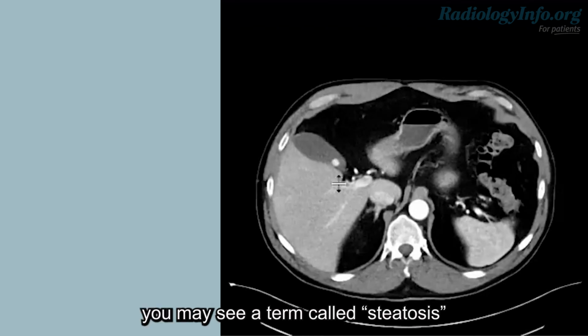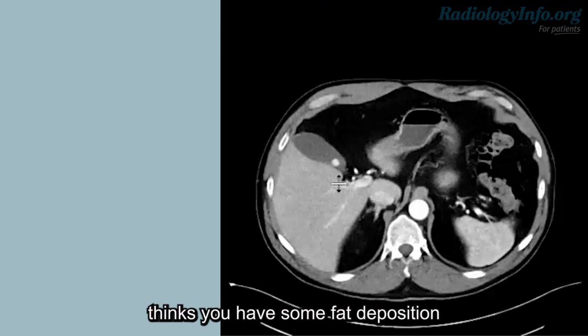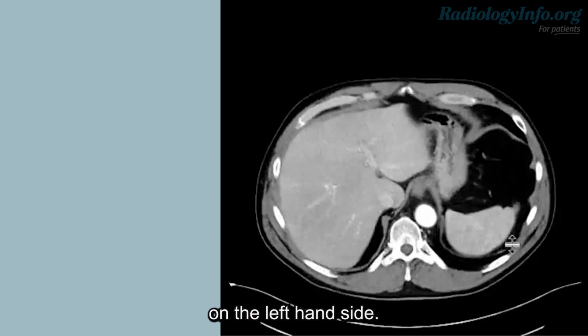When describing your liver, you may see a term called steatosis or steatotic liver. This simply means the radiologist thinks you have some fat deposition inside your liver, and this can sometimes cause lab abnormalities that your doctor may want to discuss with you. This is your spleen on the left-hand side.